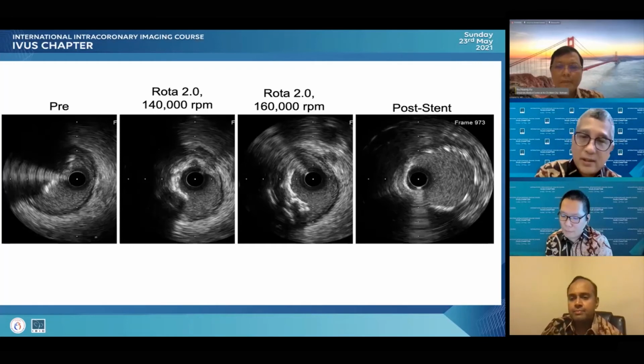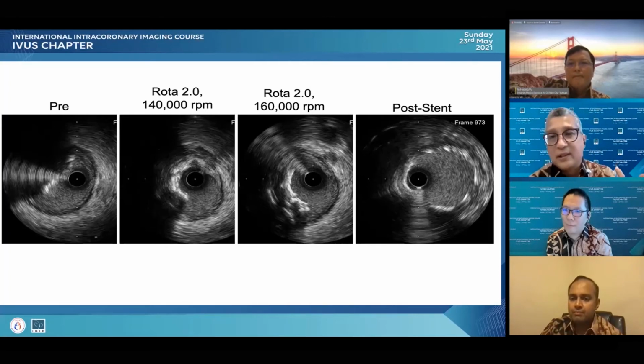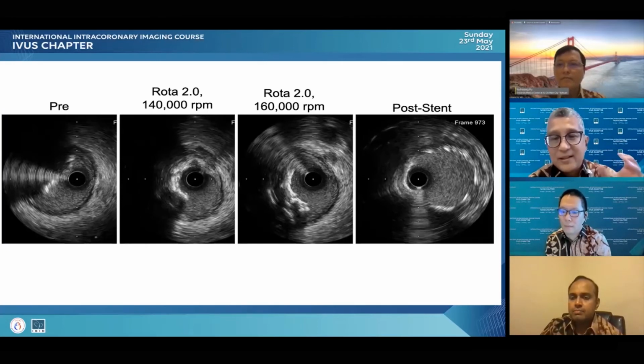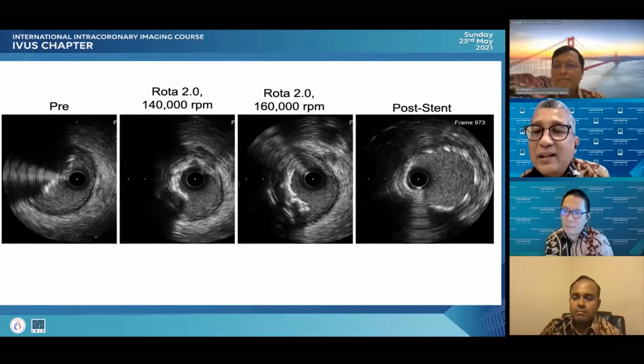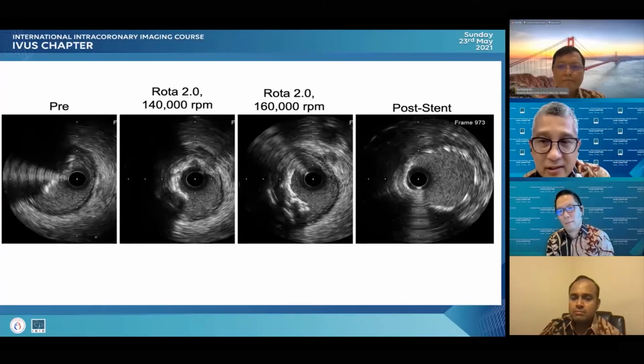All right, thank you. I have seen many perforations, maybe related to this kind of issue, especially in very tortuous vessels with eccentric plaque, which is very devastating. But for a not very tortuous vessel, a relatively straight vessel, if you have a wire bias, is this also dangerous? Is there any issue in that? Akiko, maybe you can help me. With the calcified nodule, you have a wire bias, but it's a relatively straight vessel. Is this really an issue now? I don't know.